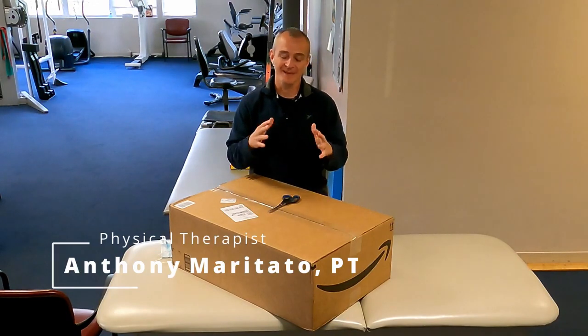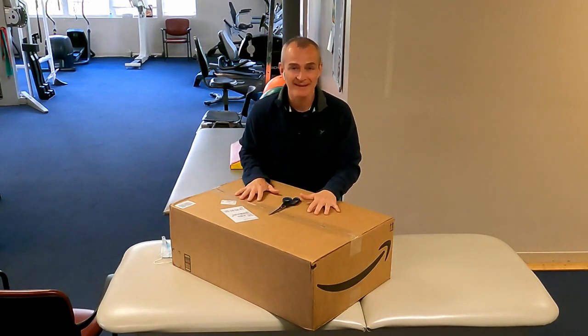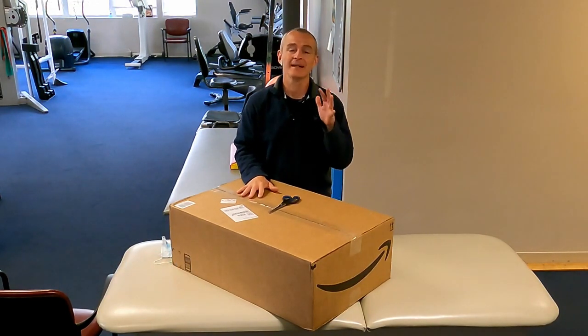Welcome guys, my name is Tony Maritotto, I'm a licensed physical therapist, and today I'm unboxing the Drive Medical Bella Vita bathtub lift chair. This is not a paid promotion — Drive Medical did not send me this for free. I actually purchased this out of my own pocket, specifically for a patient of mine who's been having a hard time getting in and out of the bathtub. But I have a secret purpose in mind that I want to test this device for, and if you watch to the end I'll show you what I'm thinking.